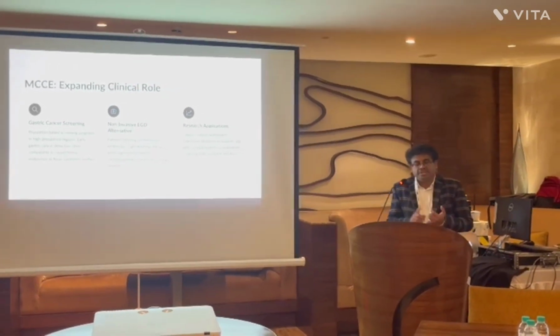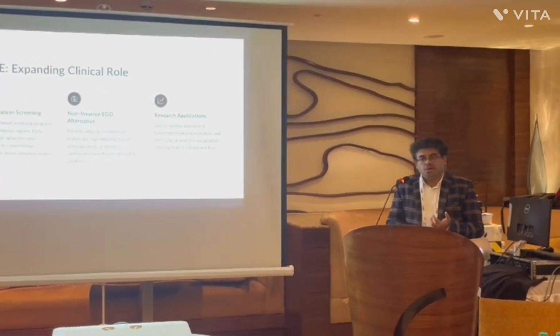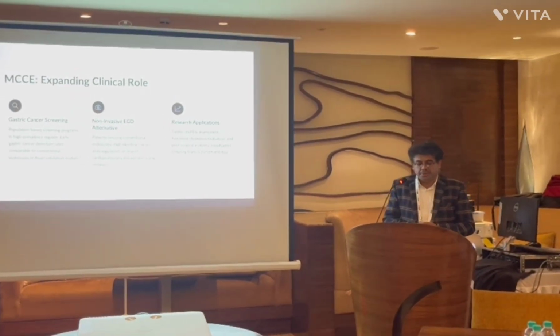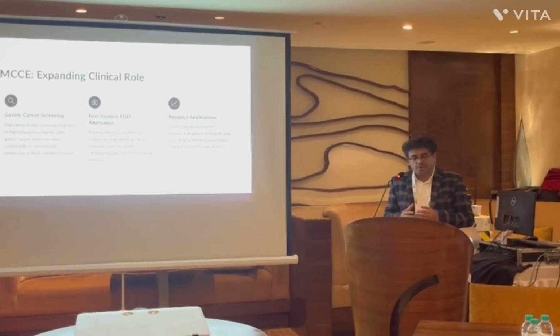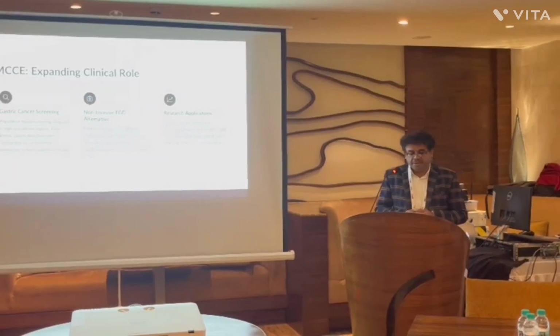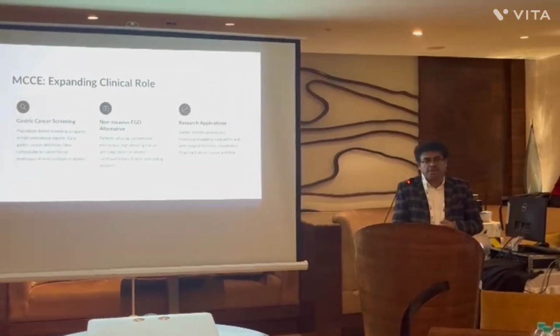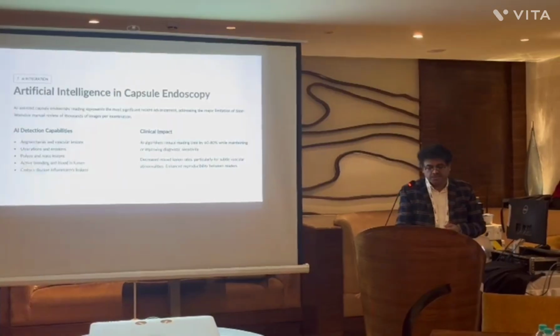MCCE has a role in gastric cancer surveillance and non-invasive assessment of the esophagus. As a diagnostic alternative, we can use it in high-risk bleeding patients, those on anticoagulants, or with severe cardiopulmonary disorders, and for research applications in gastric motility assessment. You can use your MCCE for all those things.